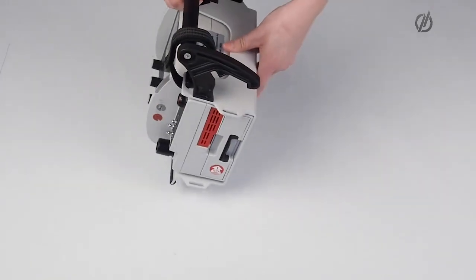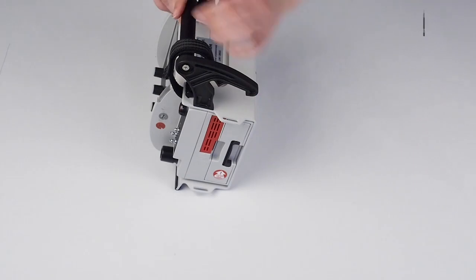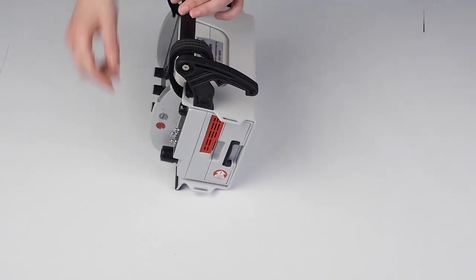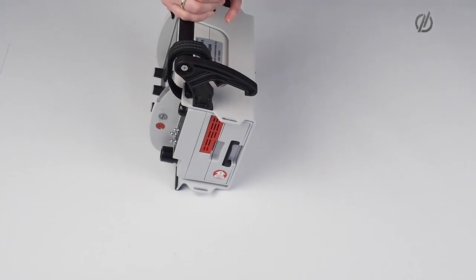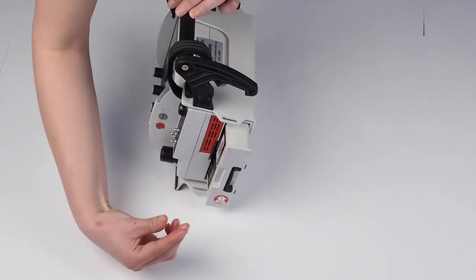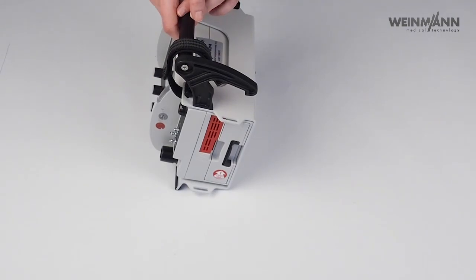And on the left-hand side of the device, we have our air intake via this hygienic filter that filters air coming into the device from virus and bacteria. And we have our internal battery, which lasts about 9 hours under standard ventilation and can be easily exchanged by just clicking like this. And when you plug in the battery, make sure that you always hear a click to ensure that the battery is safely inside.